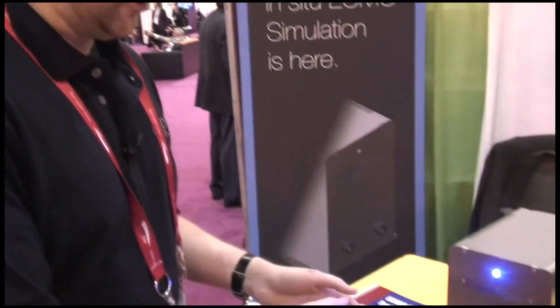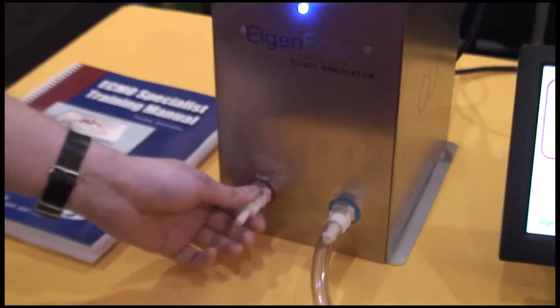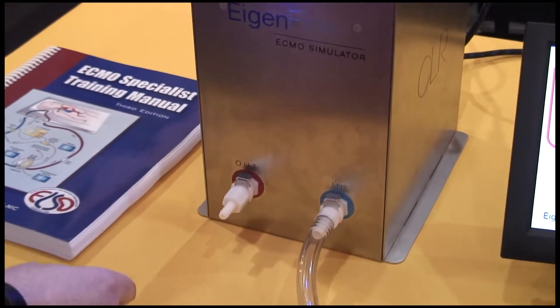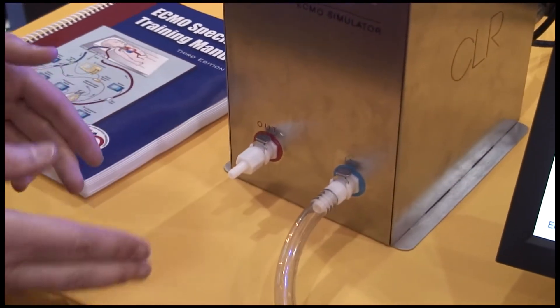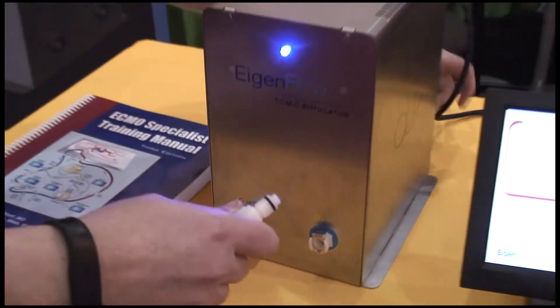If you look down here at the eigenflow, we've got a venous side and an arterial side marked by blue and red. What we would do is we would take the ECMO circuit, cut it into two different places, and then insert inline from the back.